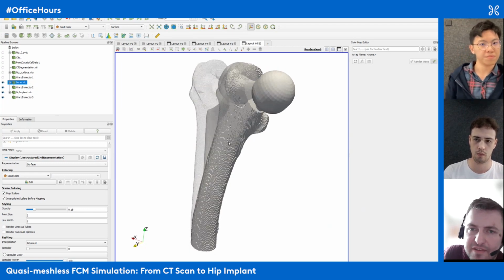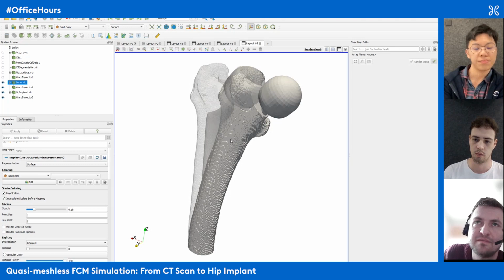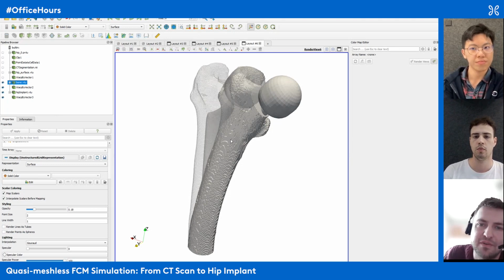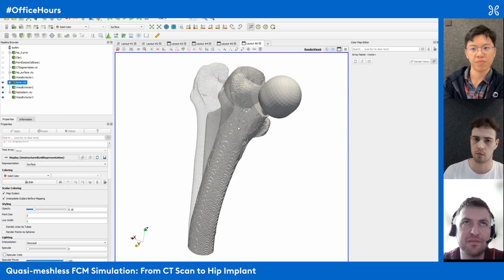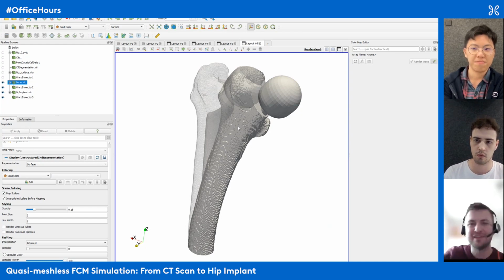And the good thing is that now you can get almost instant feedback about what would happen if I changed the shape of the implant. How would the stresses redistribute, or how would the whole deformation pattern change? And I think this is something that is probably extremely easy to do with Hyperganic: come up with an army of different implants. Right. Small lattice, big lattice, lattice oriented in one direction, lattice oriented in the other direction.